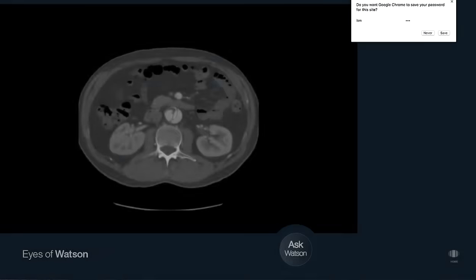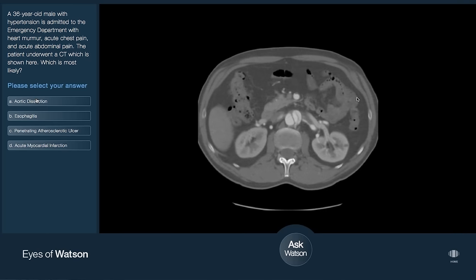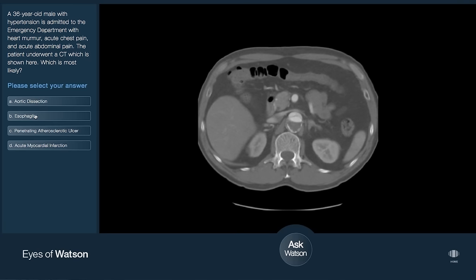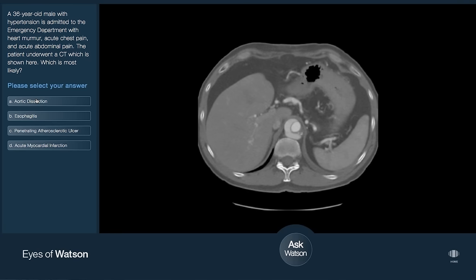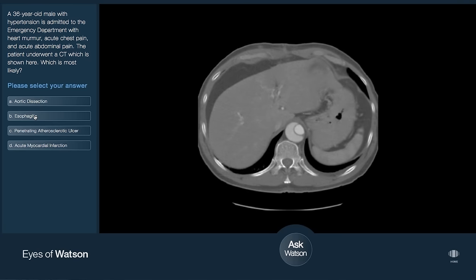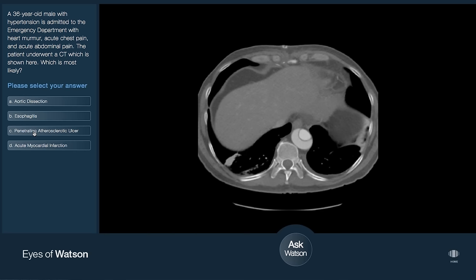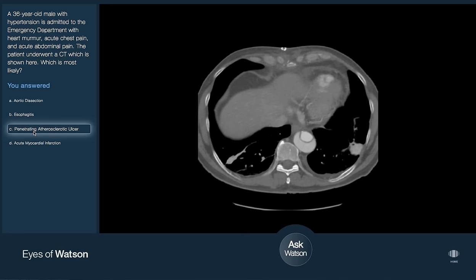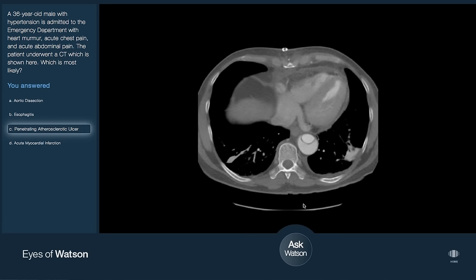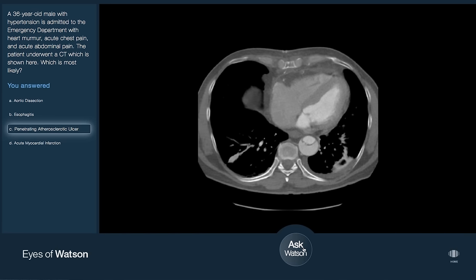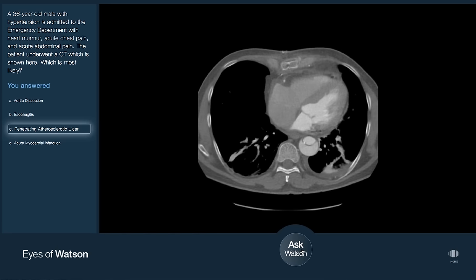You can examine the imaging study and read the associated case description. Select the appropriate conclusion. To see how Watson would attempt this case in real-time, select Ask Watson.